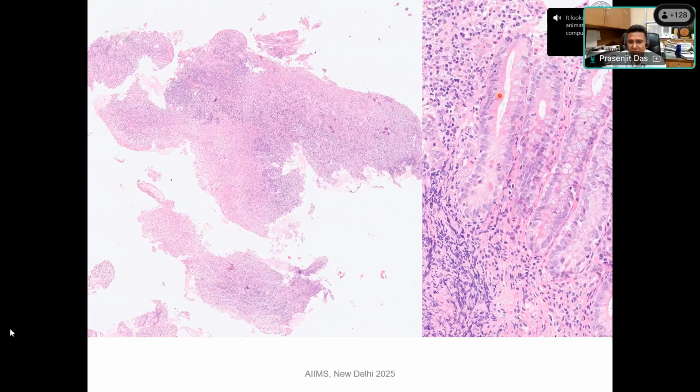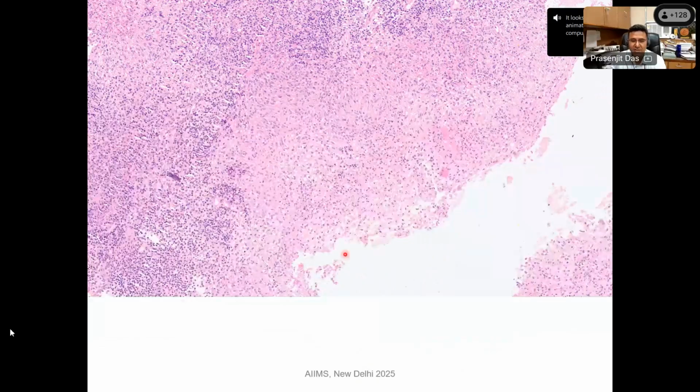So anyway, what we could tell at this point, there is activity and there is chronicity, that is patchy. So again, it is a patchy chronic active disease. Let us see further images. So this is patchy chronic active colitis. That will be your microscopic finding at this stage. Now what can you see in our higher power? Here, anything?